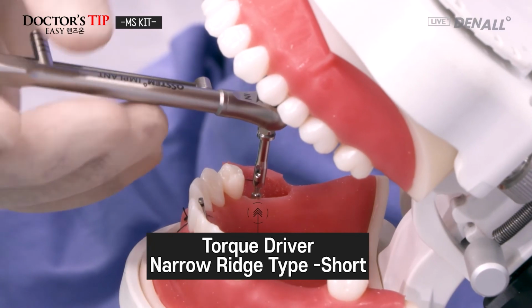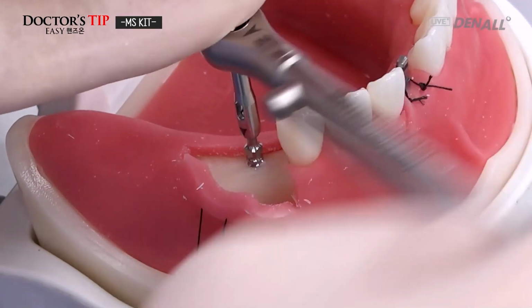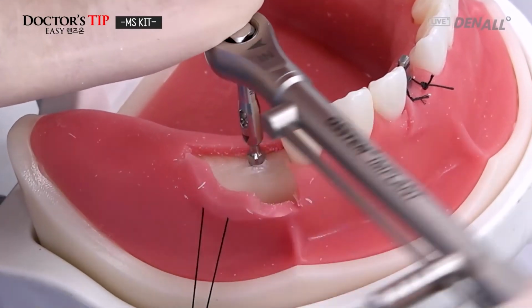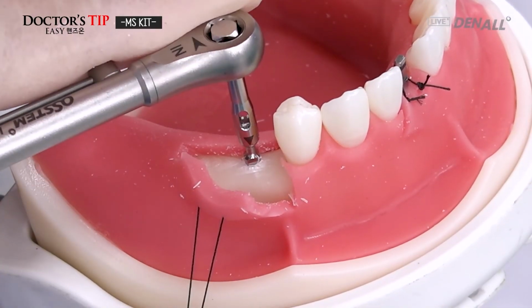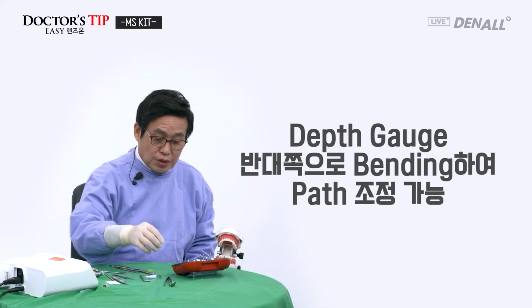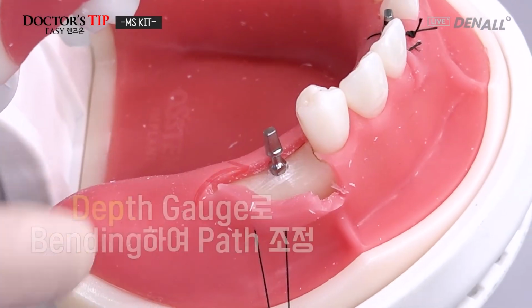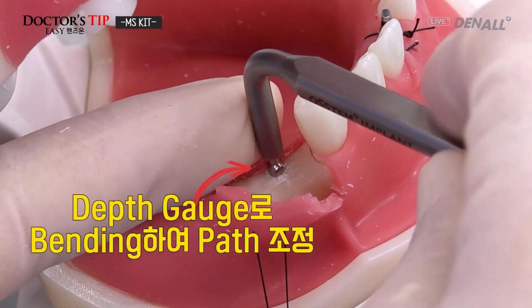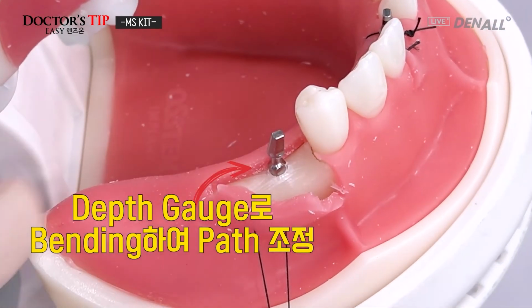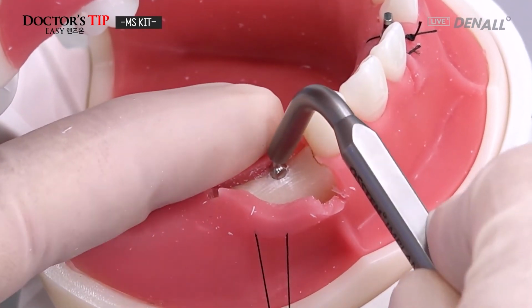Depth adjustment. So depth is adjusted. And like this, in case of a provisional, if the path is not correct, the backside of the depth gauge can be used. For a provisional implant, if you don't like the positioning, you push in the depth gauge like this to bend the implant to the position that you want. Like this. Again, it's bendable.